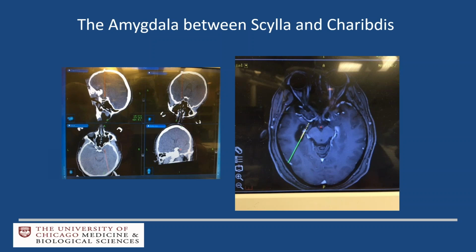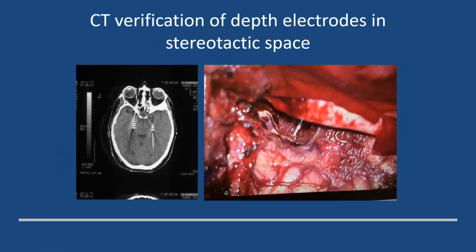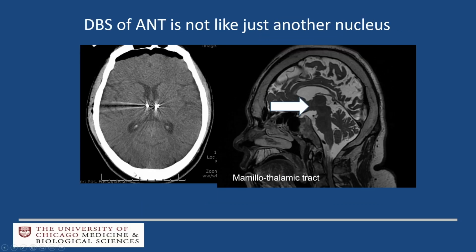and you can see they're almost completely coincident. Sometimes, to make life easier when you have to do either an open resection or, in this case, a selective amygdalohippocampectomy, we put the depth electrodes very close to the brainstem and the tentorium, and you can leave them in basically as a marker. So when you see your electrode under the microscope, the next thing you'll see is the tentorial edge, which is very helpful.